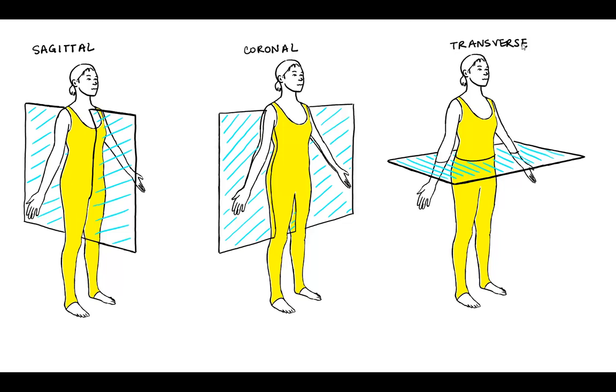It turns out that no lead runs in the sagittal plane. There is no vector in the sagittal plane when we're trying to record an EKG. So from now on, we can just not care about this one. But the limb leads actually lie in the coronal plane, like this. And the precordial leads lie in the transverse plane, like this. And I haven't drawn all of them, but you kind of get the idea. They all run in this plane, and they're sort of splaying out of the person. It's as if a bunch of arrows is coming out of her body.